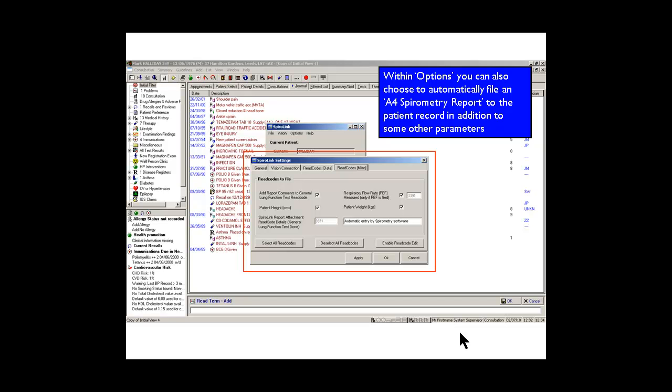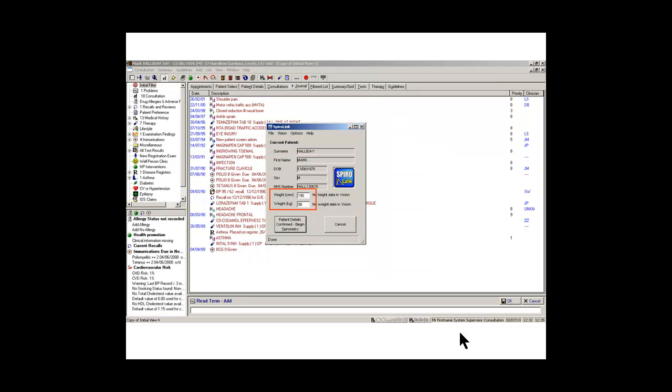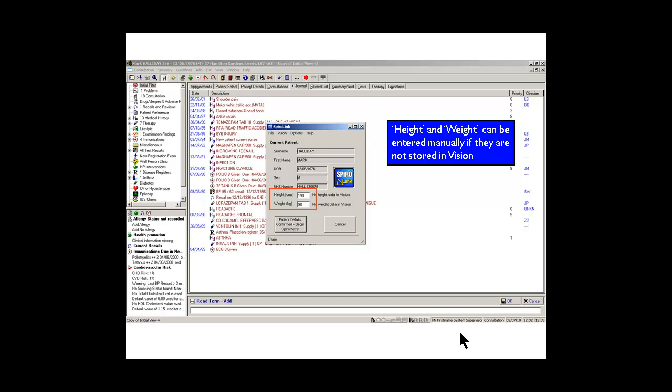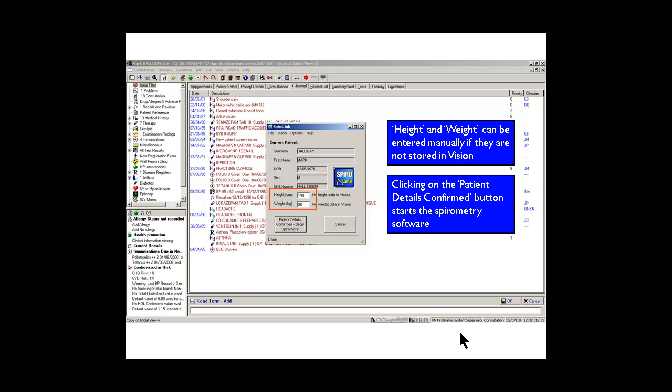You would do this once and probably leave those settings until you wish to change them again at a later date. We can now begin performing the test after we've put the height and weight in. These will be put back onto Vision. We can confirm the details and begin the spirometry test.